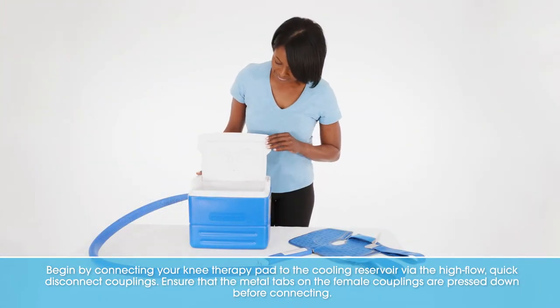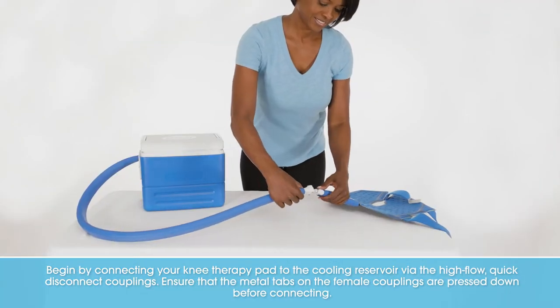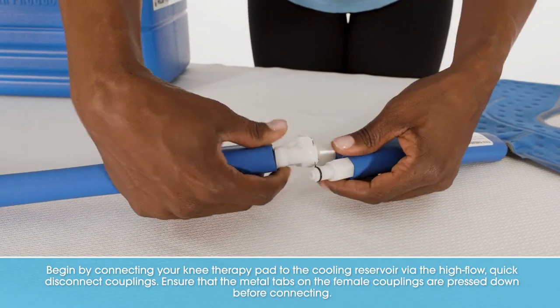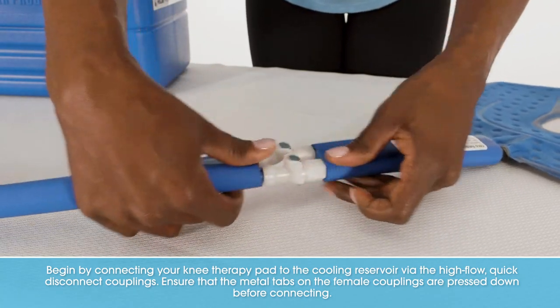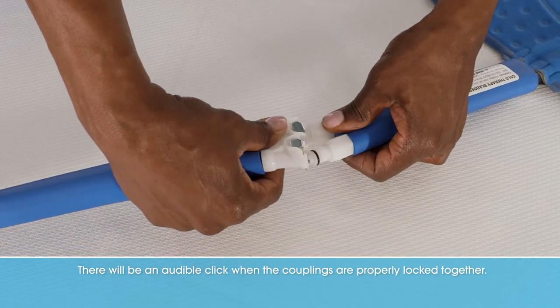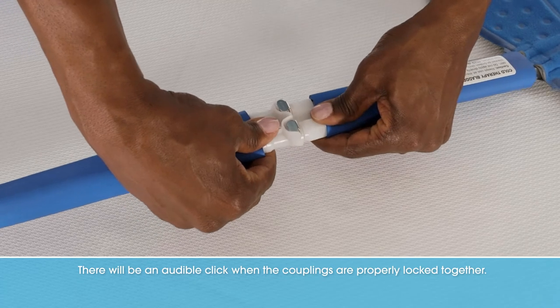Begin by connecting your knee therapy pad to the cooling reservoir via the high-flow quick disconnect couplings. Ensure the metal tabs on the female couplings are pressed down before connecting. There will be an audible click when the couplings are properly locked together.